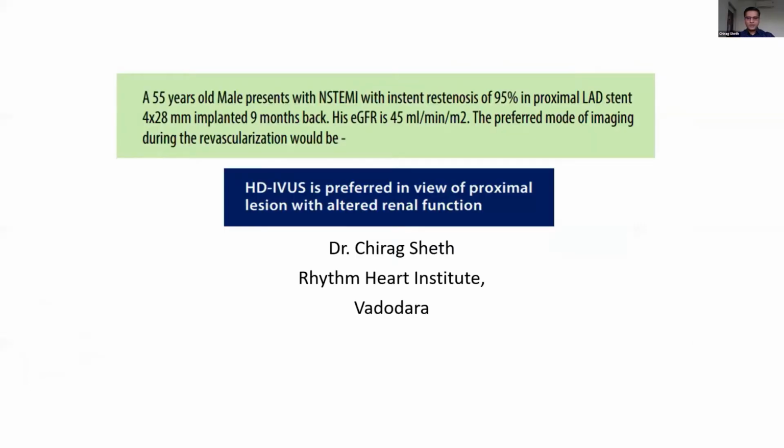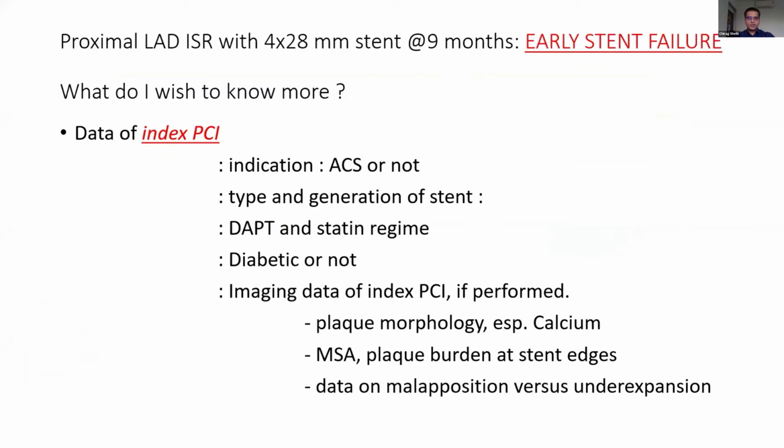So, good morning, everyone. Thank you, Dr. Kamal Sharma, for inviting me for this debate. Straight away, I think we have been introduced to the case, and I'm going to focus on the discussion about HD-IVUS, and how preferred it is in view of a proximal lesion with altered renal function.